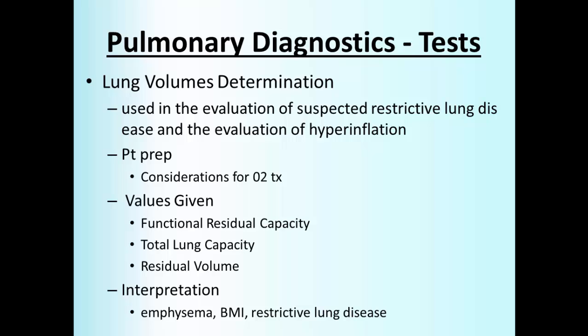Obstructive lung diseases, particularly emphysema, result in an increase in the RV and the RV to TLC ratio. Increased body weight due to increased fat causes an increase in chest wall elastic recoil, which favors a lower end-expiratory lung volume, resulting in less hyperinflation for any degree of airflow obstruction. And reduced TLC is the hallmark of restrictive lung disease, such as interstitial lung disease, atelectasis, pneumothorax, consolidation, edema, and fibrosis.